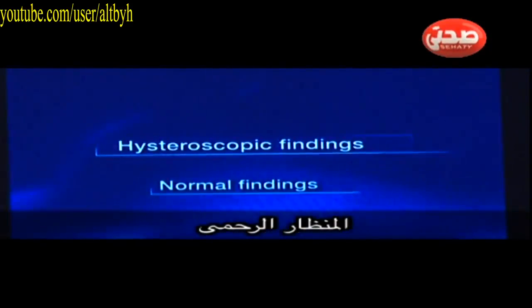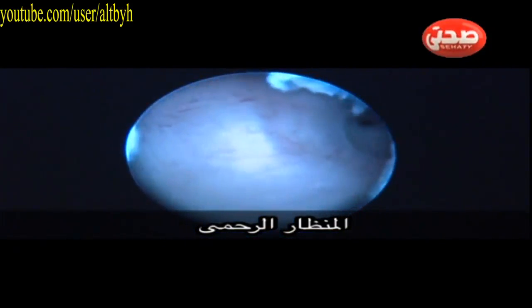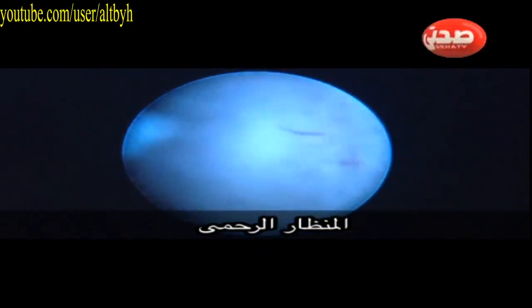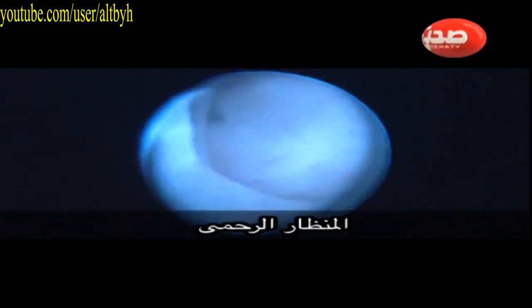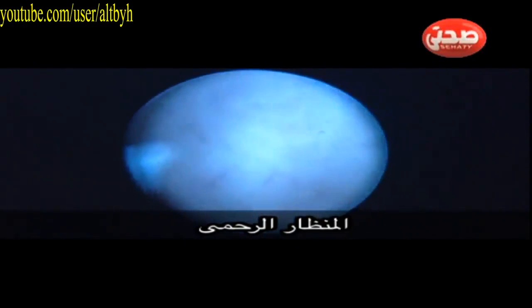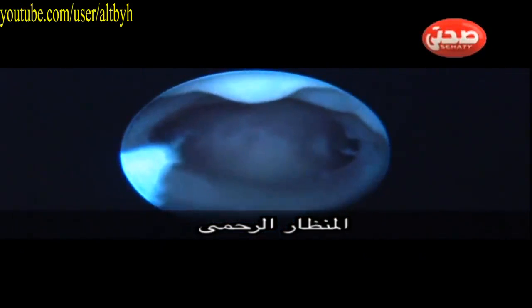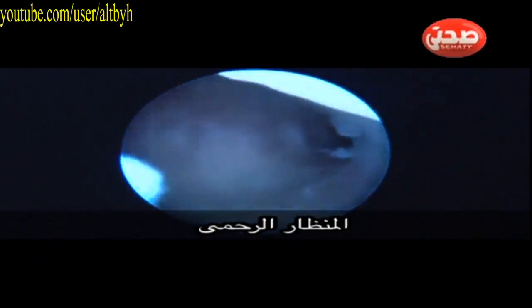And to comment on the hysteroscopy findings, some are normal, like in this case, a lady who had postmenopausal bleeding. You can see the atrophic endometrium with no pathologies at all, and both ostia were seen clearly in the panoramic view, as you can see there. So it's very important to have a quick look and also to have a systematic review of the whole cavity.